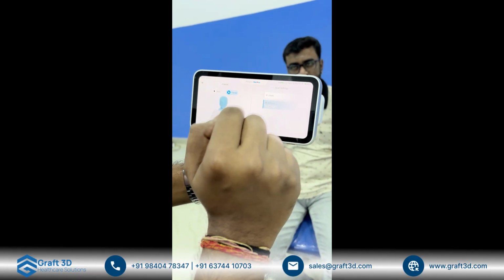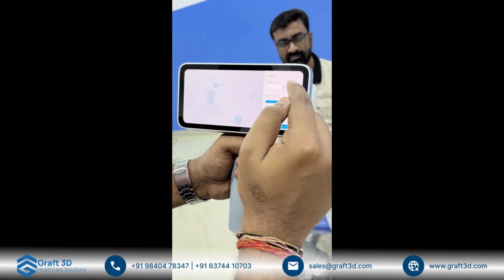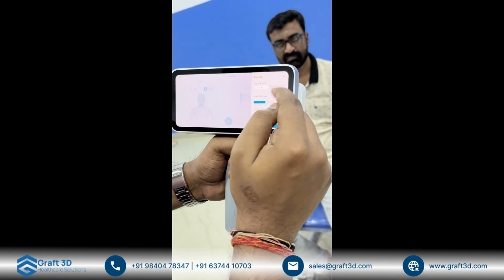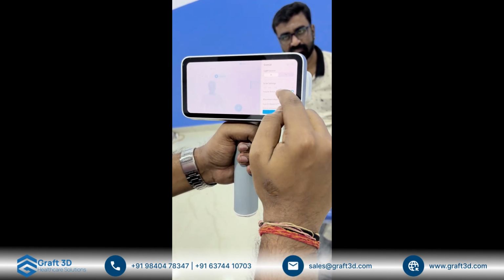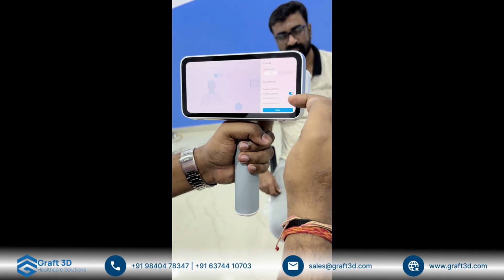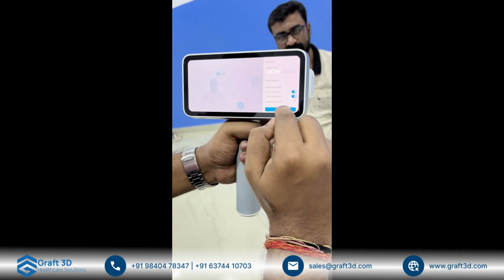So I'll just set over here what should be the resolution of it, which light source I'm going to work with, infrared or white light. Let's say infrared. I want the texture, so I'll go with the texture. Alignment mode: feature align, texture align, marker align. I don't have the marker, so I'll deselect that and use texture align. Okay, and I'll save this.